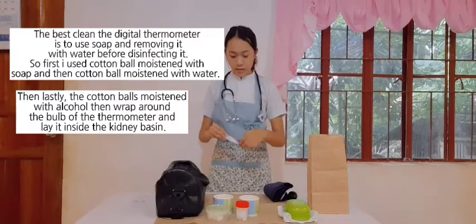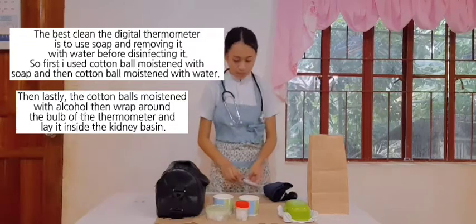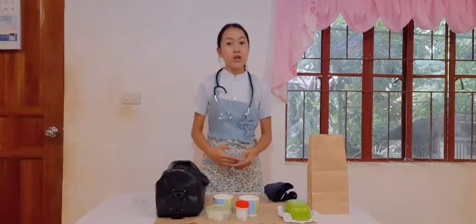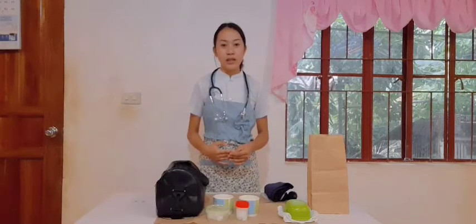Clean the thermometer in a downward spiral motion from the stem to the bulb. After the care is given and health teaching is over, remove the cotton ball wrapped around the thermometer and wipe with a dry cotton ball and return to the case.